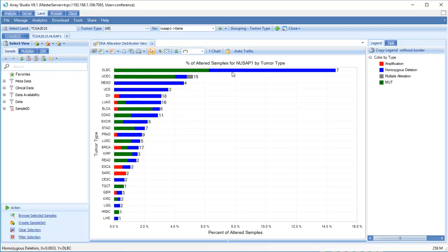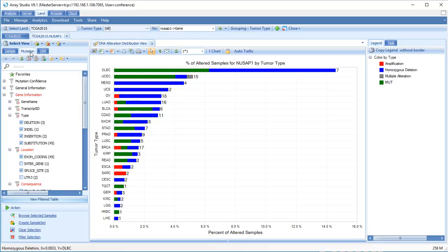The types of mutations shown can be changed under the Mutation Filter tab, and details of the mutations in these samples can be viewed by clicking View Filtered Table.